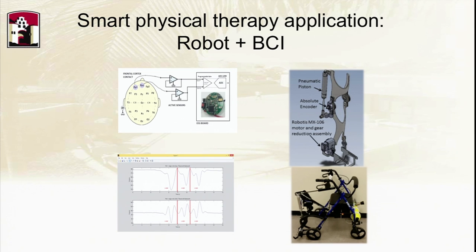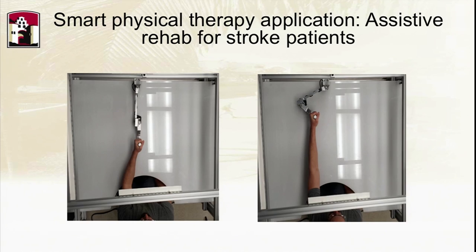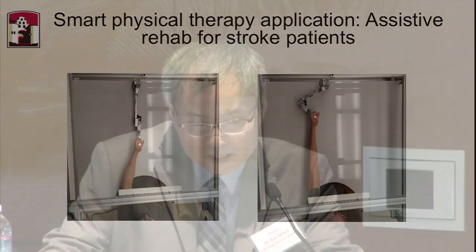This one gives the idea of the walking device, and also the arm rehab device, and it shows the lab of one of our faculty, Dr. Sims, with the arm rehab device for stroke patients. What we do is based on a hypothesis: when we do rehab, the human therapist uses the arm or leg and repeats the motion, expecting the plasticity of the brain so that we can have that rehab.